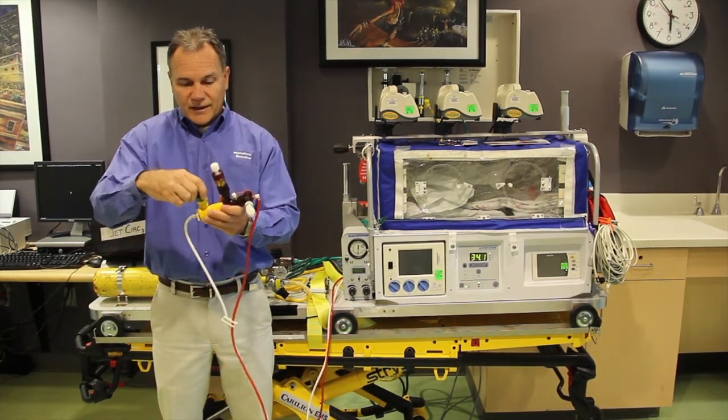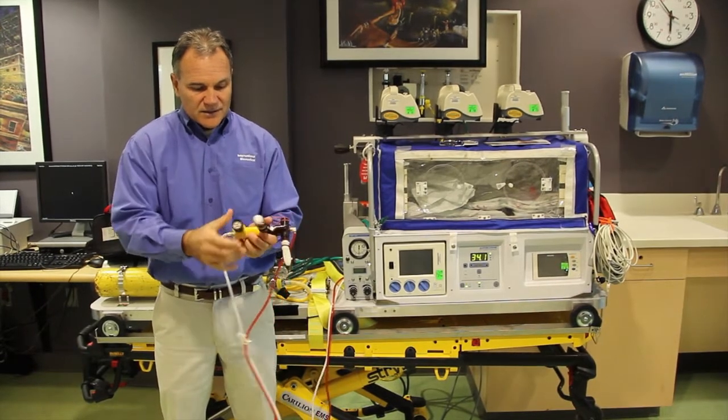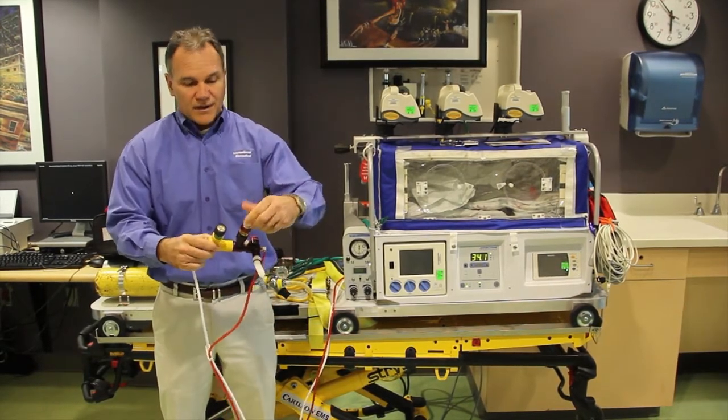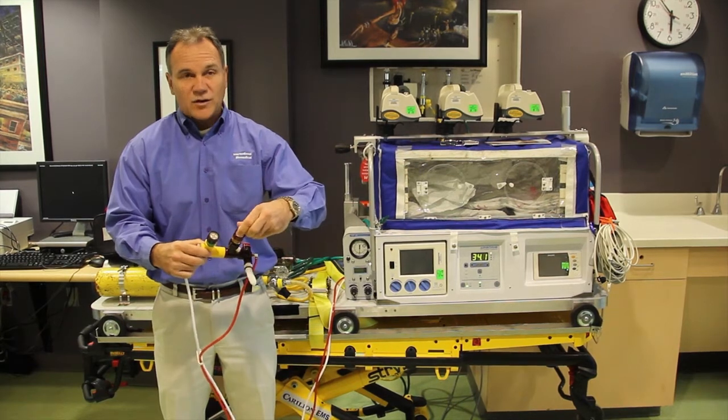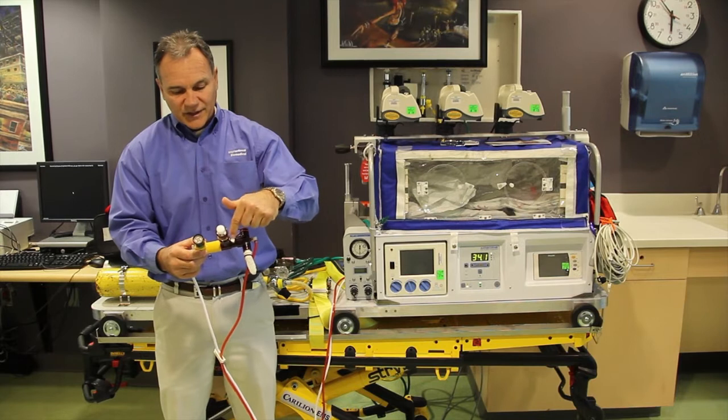On top here we have an entrainment port, and then that actually pops off. Next to that we have a peep knob, and the way that the peep knob works controls your mean airway pressure. There's a port right here for feeding in nitric oxide.